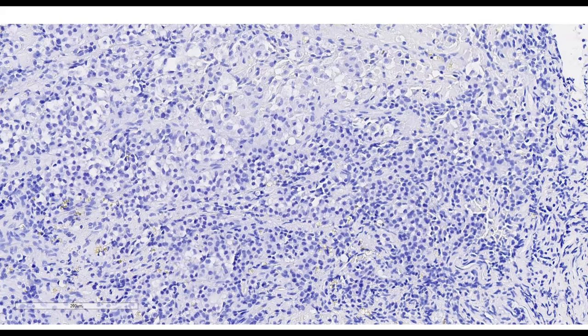Again, for the pathologist, you don't need H&E. You can do it off the hematoxylin. Some things are even clearer. Sometimes it's easier to see mitotic figures on the hematoxylin only. Many times when mitotic figures are critical, I can't find them on H&E, I go to the hematoxylin. Sometimes it's sharper, clearer, without all the distraction of the protein.